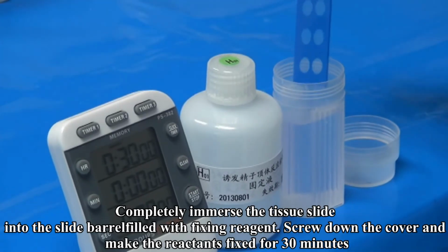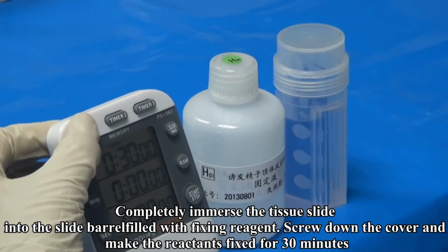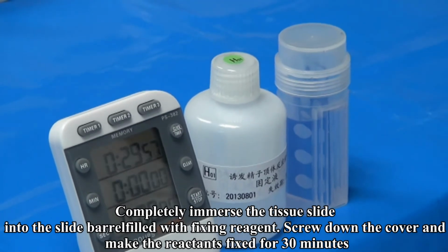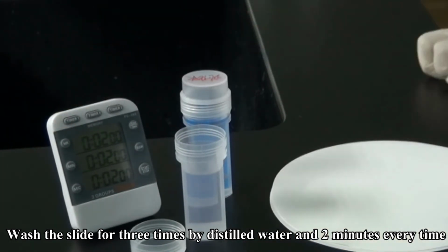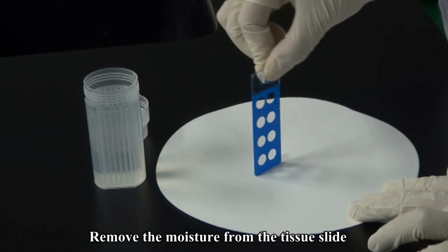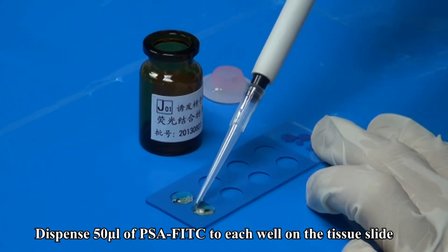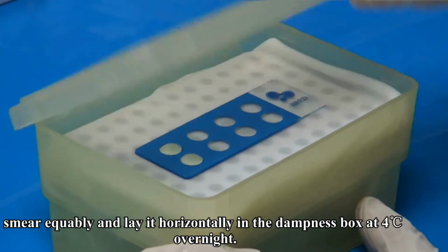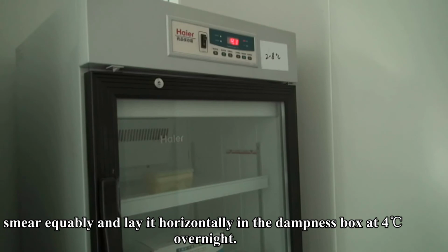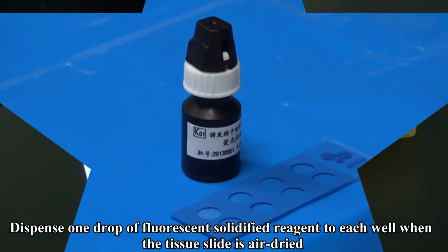Completely immerse the tissue slide into the slide barrel filled with fixing reagent. Screw down the cover and make the reactants fix for 30 minutes. Wash the slide 3 times with distilled water, 2 minutes every time. Remove the moisture from the tissue slide. Dispense 50 microliters of PSA FITC to each well on the tissue slide and smear equably and lay it horizontally in the dampness box at 4 degrees Celsius overnight. Remove the PSA FITC and rinse it with distilled water 3 times, 2 minutes every time.